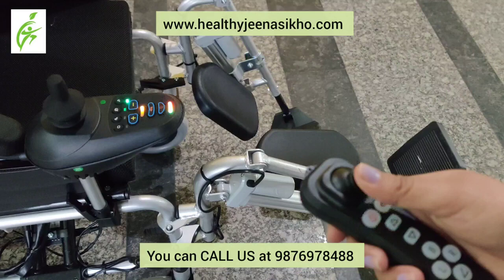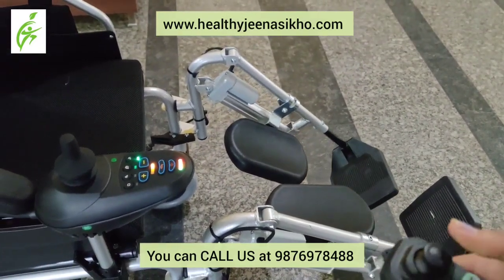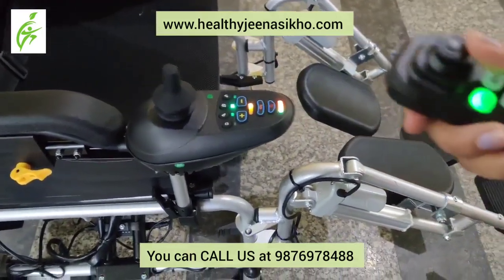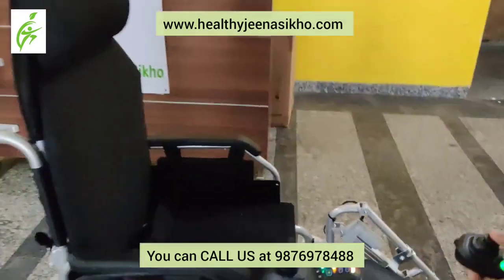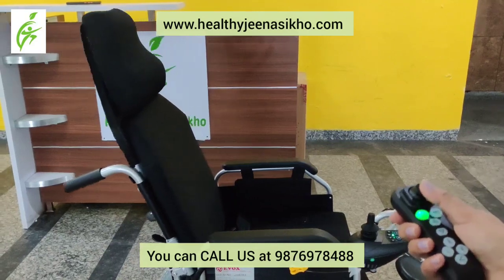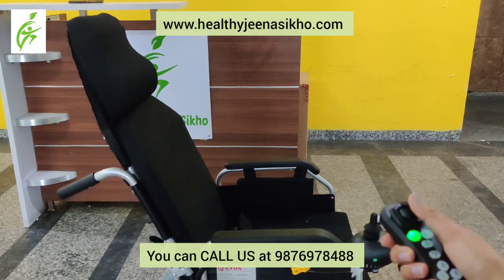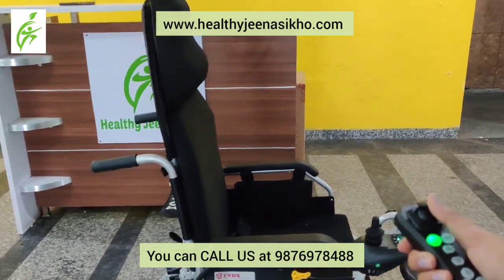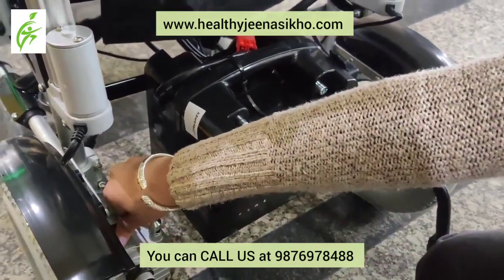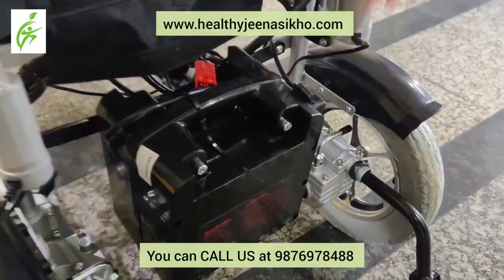You can sit the patient and watch TV, socialize, go to the office, and keep your life independently. It is a reclining wheelchair and you can also use it in manual mode, as you can see.